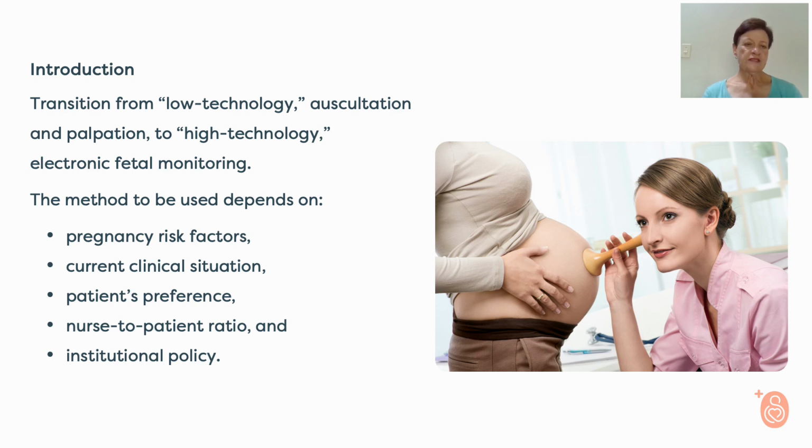Whether we use the CTG or not depends to a large extent on pregnancy risk factors, whether there are or not, the current clinical situation in the hospital or in the clinic where you work, what is available and what is not available. Then, very importantly, the patient's preference. Yes, the patient has a choice whether she wants her baby's heart to be listened to with the CTG or not.